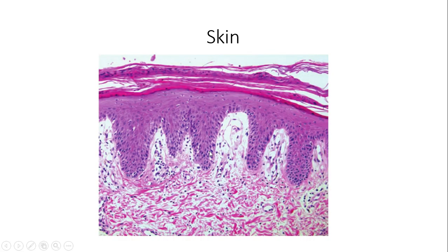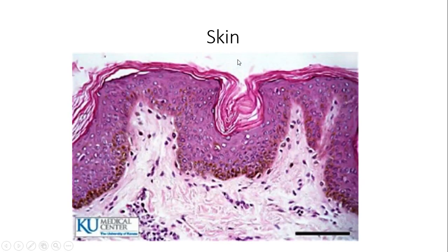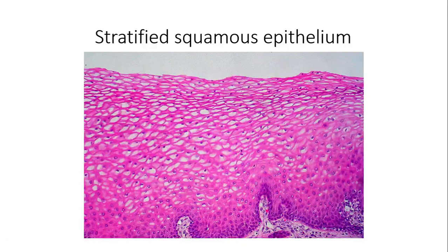This is actually a good example because we're starting just here and we see all these different layers, but you can see all the dying off cells here, which is characteristic of skin, because remember, you always have skin dying off at the apical surface. It's always regenerating. But remember, for skin, you just have to say it's just skin. Okay? When you see something like this, you're going to say it's stratified squamous.